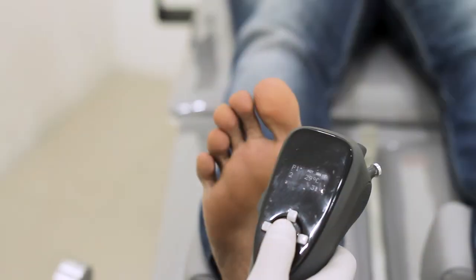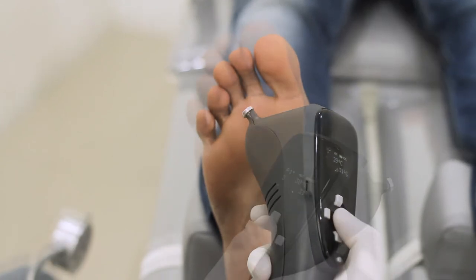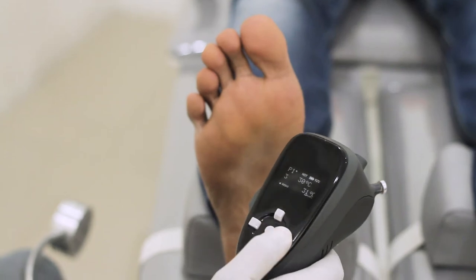Do not place the hot probe continuously against the test points for more than 5 seconds. Press center key to freeze the value when the subject affirms. Press right key to save the value of the result at the current point.